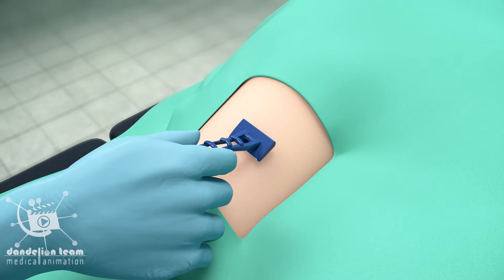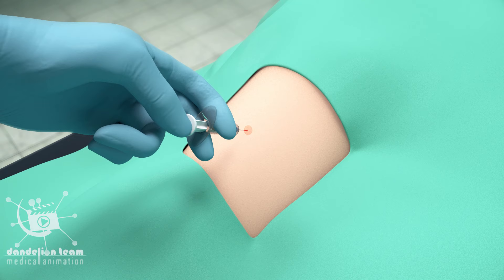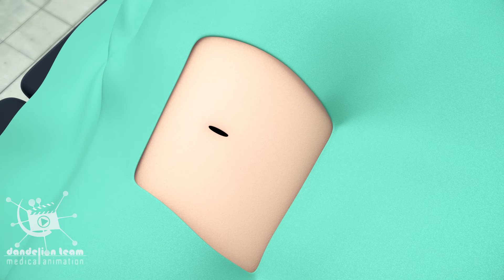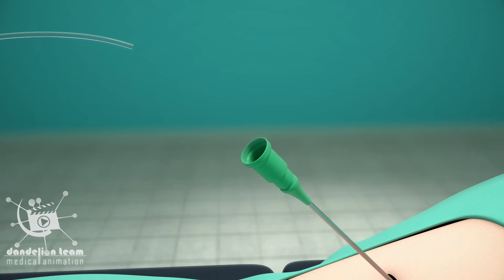A small amount of hair may be shaved from your groin, wrist, or arm. Then the area will be numbed with an injection of a local anesthetic. A small incision will be made at the entry site, and a short plastic tube called a sheath will be inserted into your artery.